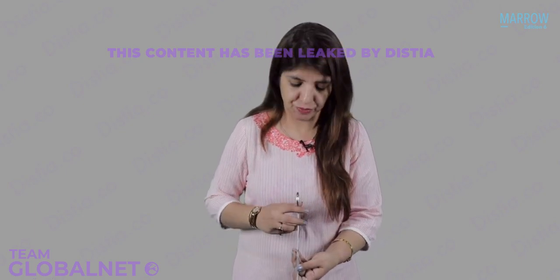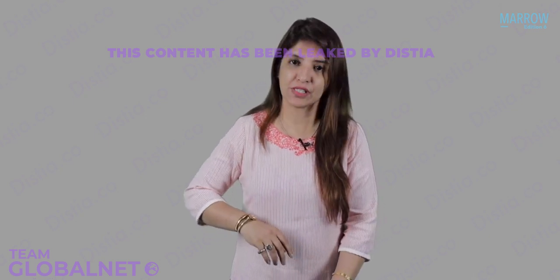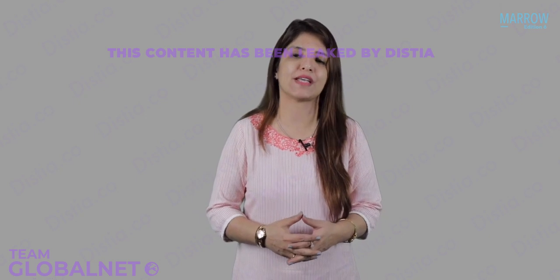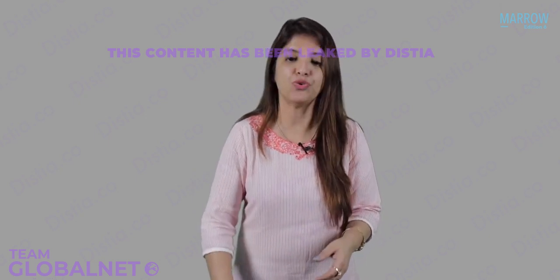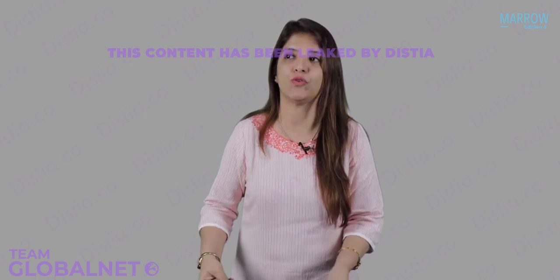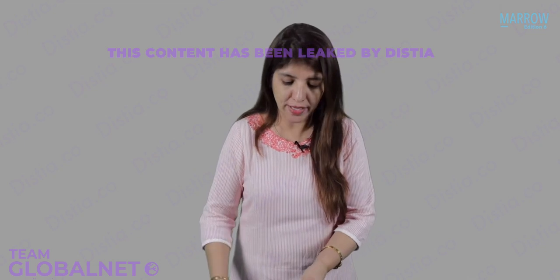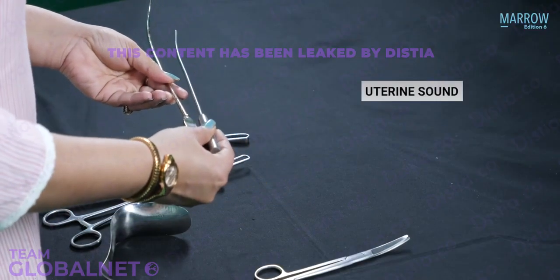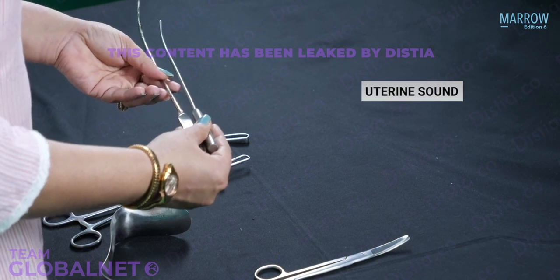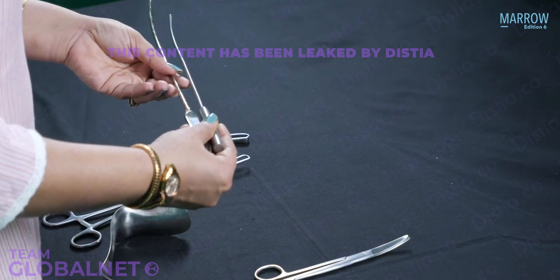Now, after I have held the anterior lip of the cervix, the next thing which I have to do is I have to see the length of the uterine cavity, and in order to measure the length of the uterine cavity, I am going to use a uterine sound. Over here, I have two sounds in my hand. One of them is a bladder sound and the other is a uterine sound. How are you going to identify which is a bladder sound and which is a uterine sound?